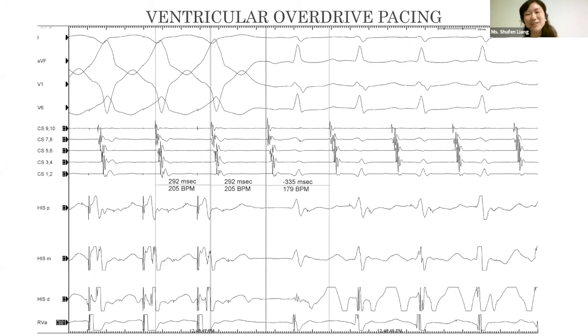Any comments from our doctors and techs? That's a crucial measurement. That means the third A that follows the V pacing belongs to the pacing spike before. And the fourth atrial signal on the CS belongs to the last ventricular pacing stimulus.